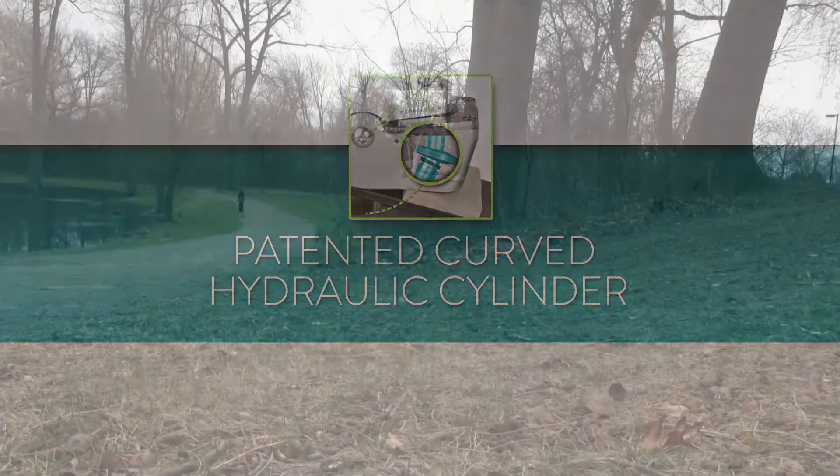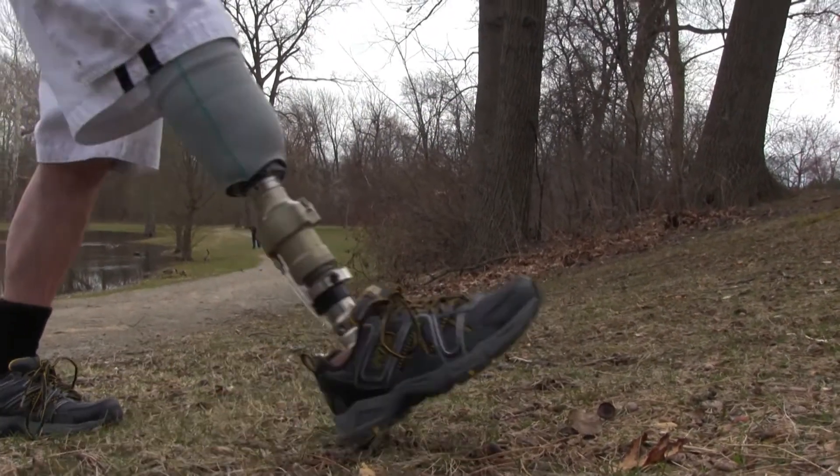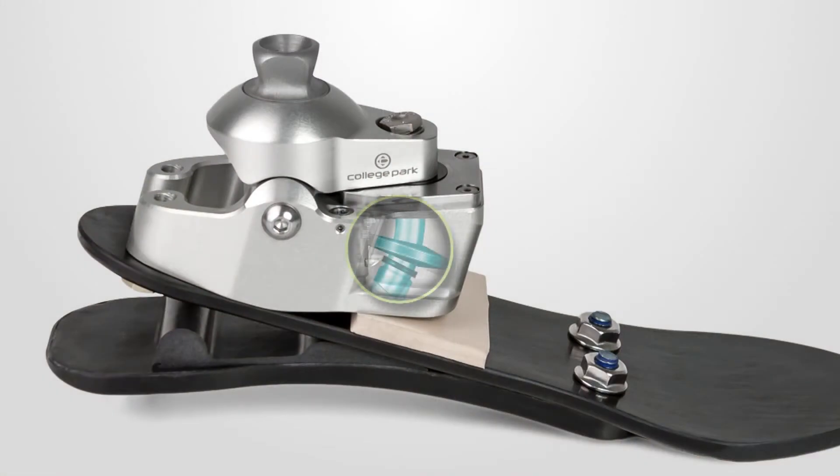The revolutionary curved hydraulic cylinder on the Odyssey K2 allows it to have one pivot point, less unit weight, and hold the record for the lowest profile hydraulic foot on the market today. One pivot point gives the foot a smoother gait cycle and longer lifespan, as fewer moving parts mean less potential wear.